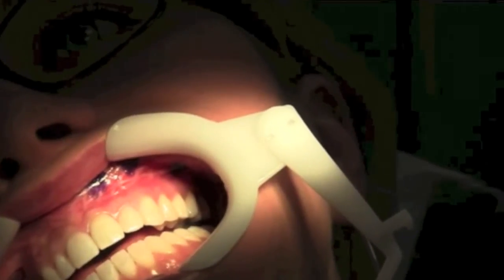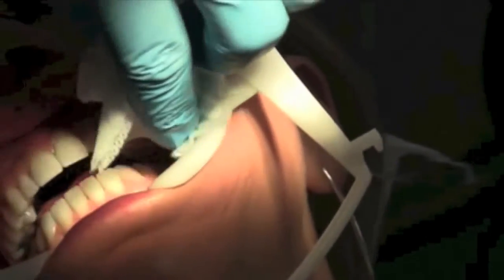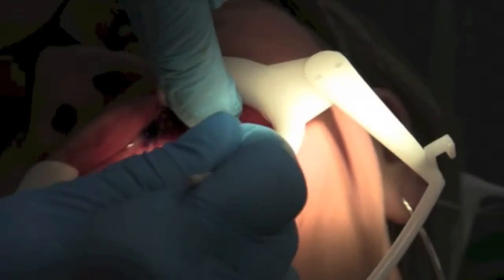So once again, you would dry the area and you would retract and apply.